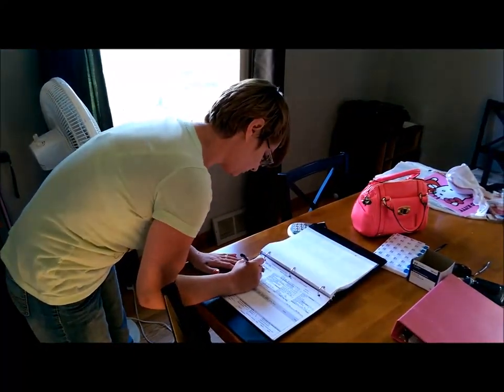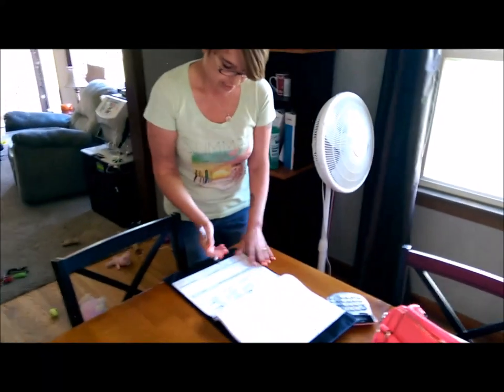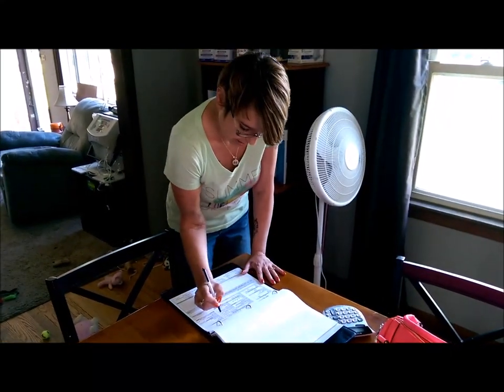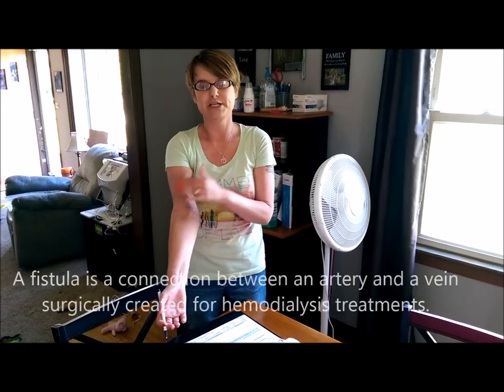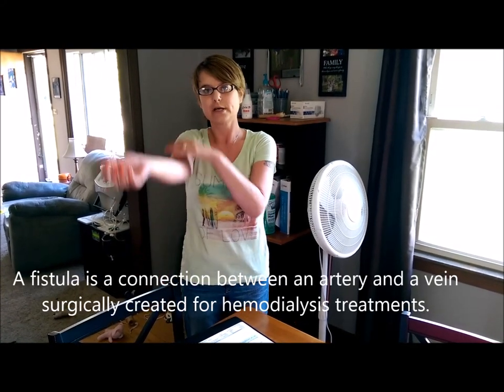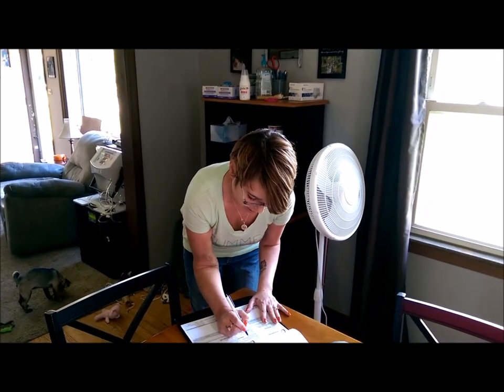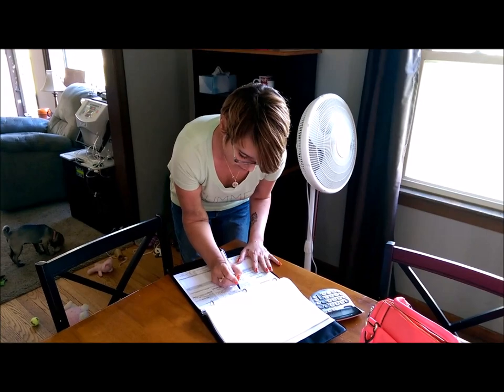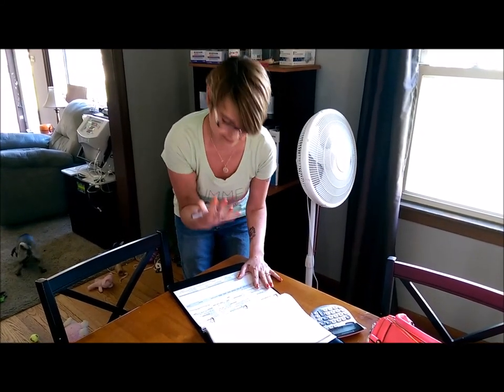One advantage of doing it at home is you have to take off less each time because you're doing it every day. You get two days off, but never two days in a row — and it's so much easier on you. Then we have pre-treatment data collection: how you're feeling, shortness of breath, is your fistula access okay, any drainage, is it thrilling, can you hear the blood rushing through — and also whether you have any digestive problems, mobility problems, or have been to the hospital since your last treatment.